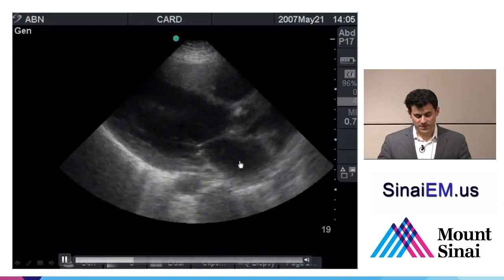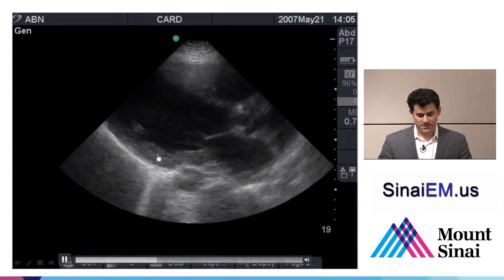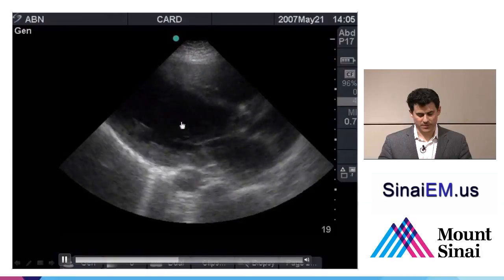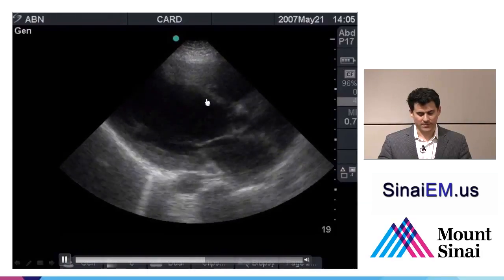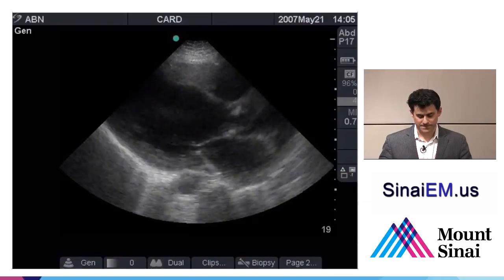Now here as well, we see poor contractility. There's a little bit of movement back and forth here. It's not terribly organized, and there's not a lot of squeeze towards the center of the chamber. And you can see, even though it's moving a little more quickly here, that the mitral valve is not really getting up very close towards the septum. So again, another example of poor contractility.